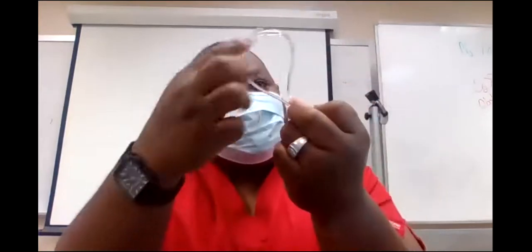And so the more air you entrain in, the less the FiO2 will be. The FiO2 is the fraction of inspired oxygen, right? How much oxygen is coming out of that binasal cannula? If nobody's on it, it's 100% coming out. But when I put it in my nose and I breathe in, I'm sucking air around it through my nose as well. And that bleeds the percentage down, okay?